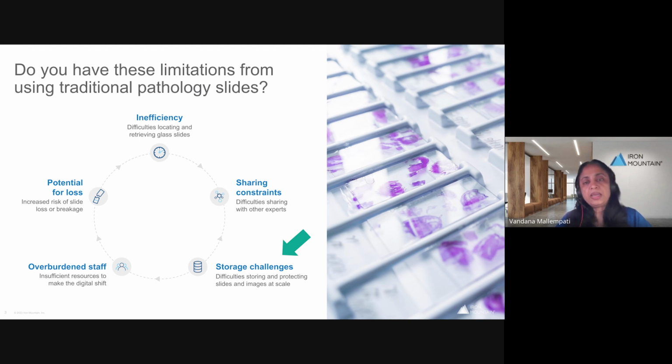Pathology slides can be anywhere from 1 gig to a gigabyte and a half for a 20 magnification slide. And that would be on a smaller slide. But if you are doing clinical, this could be anywhere from 3 gigs to, I have heard some doctors say, 9 gig slides.